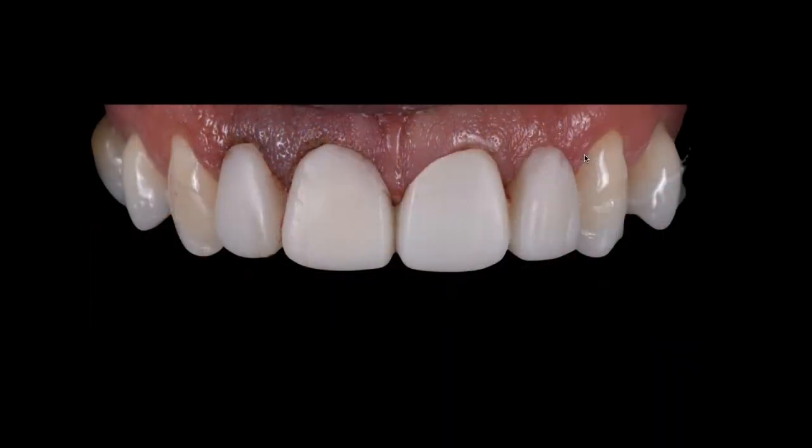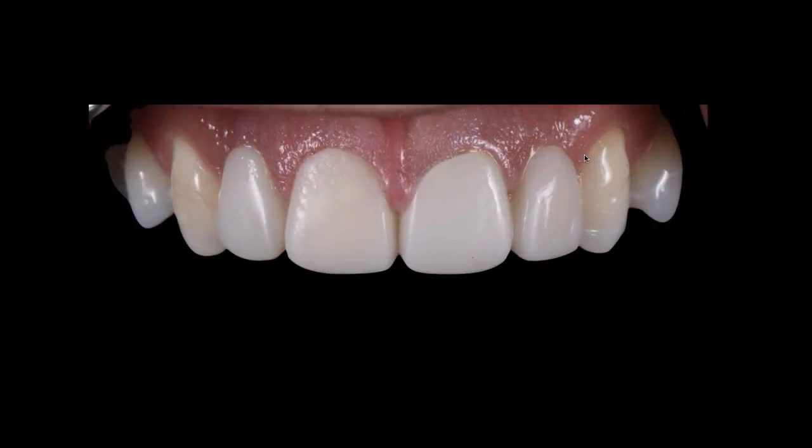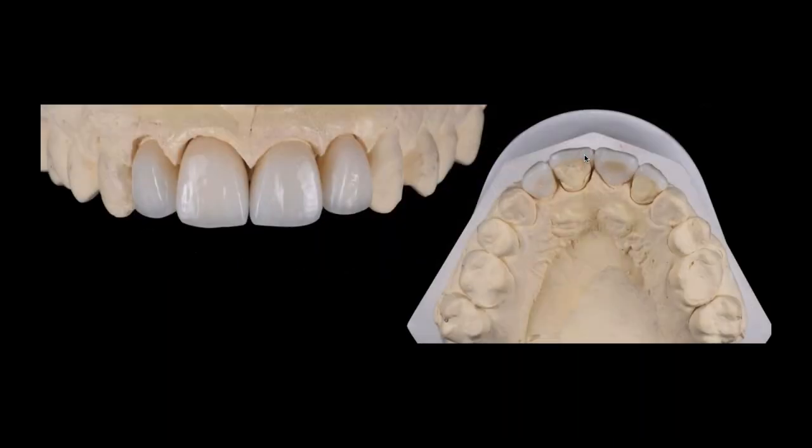And we wound up provisionalizing the patient to a point where we liked it, and then let the tissue heal, and then I fabricated 5 restorations, 4 on the maxillary, 1 on the mandible. And the restorations were made with the YZST zirconia, the white zirconia, layered with the M9, and then two veneers that were done on refractory models, also layered with the M9 material.